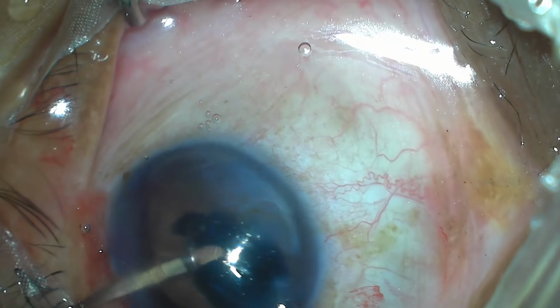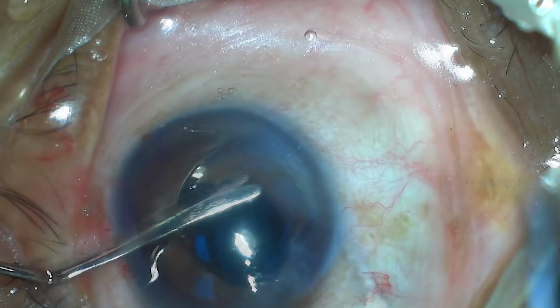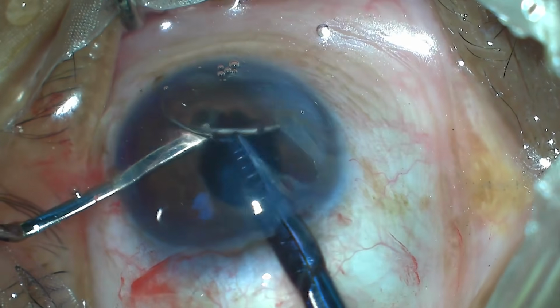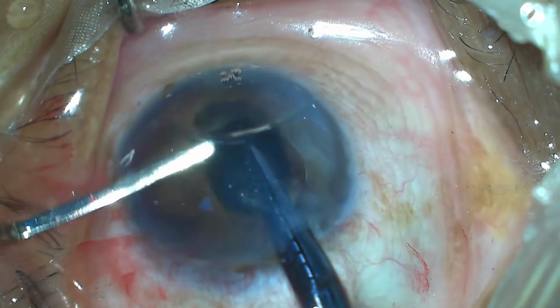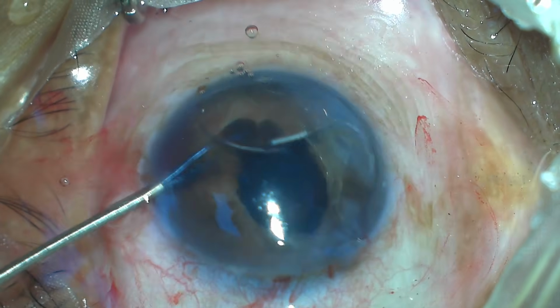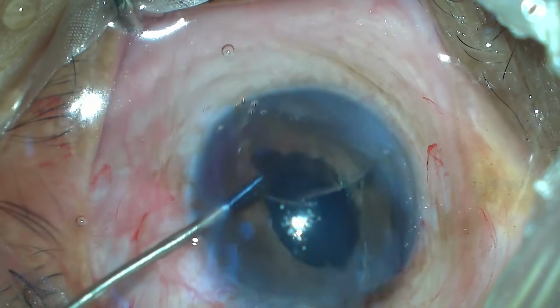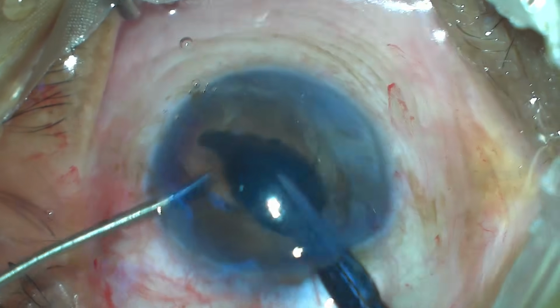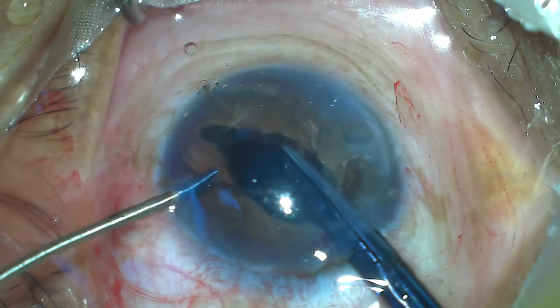The IOL is properly positioned and fixed with a spatula. The IOL cutter was introduced, but it was difficult to grasp. Now the IOL was stabilized with micro forceps from the left side port, but the cutter failed to bisect the hard rigid PMMA material even after repeated attempts.